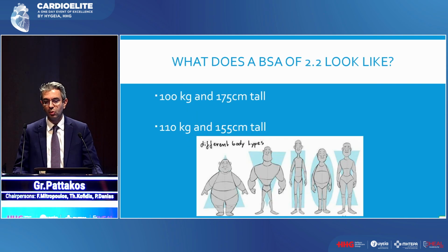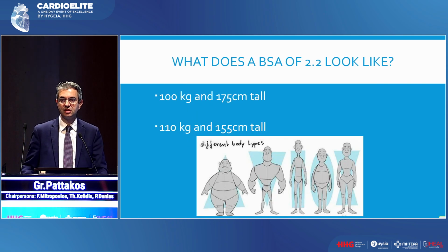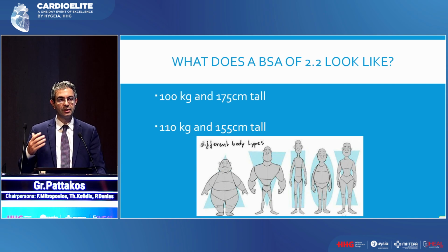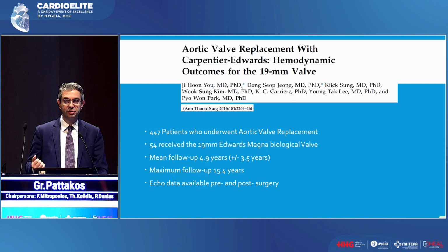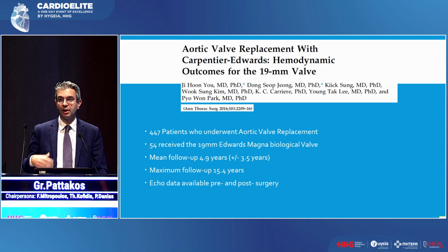So let's see what a BSA of 2.2 looks like, because this is where you start to get into trouble and to need larger size valves. So when you have patients that start reaching 100 kilos, especially if they are shorter, then they start to have a larger BSA. So when a patient walks into my office and they have a short stature and a very large body mass index, then I know that this is a patient, especially older women who have a few extra kilos. They're at very high risk of PPM, and I can envision that we're going to need this procedure.